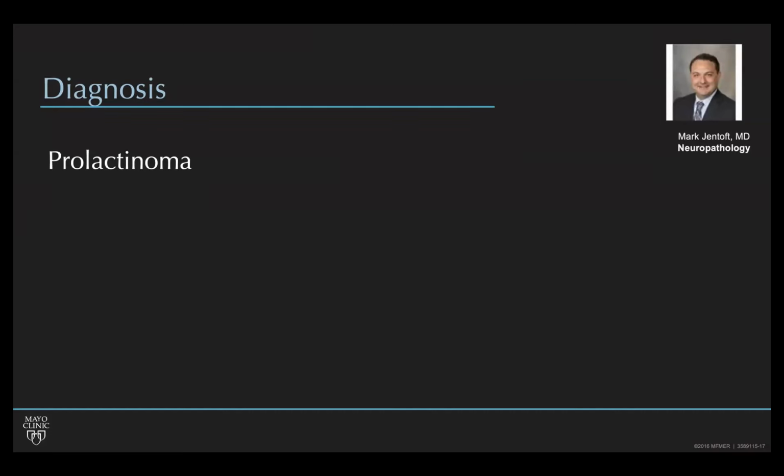Under our old WHO classification, this would have been considered an atypical adenoma. There is some controversy behind that. The current WHO doesn't use that as a classification, but they recommend you report out the labeling index if it is elevated. And my understanding is part of it was variation between institutions and variation between the percents, and whether it's done digitally or not.